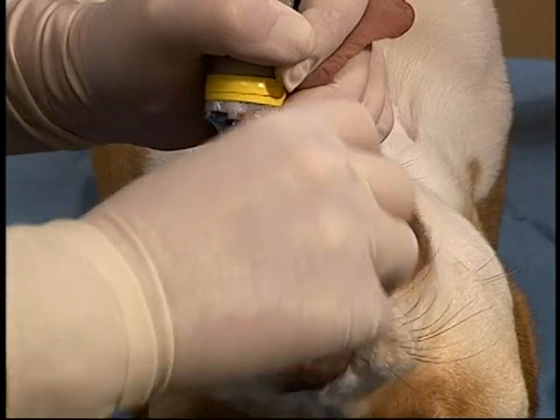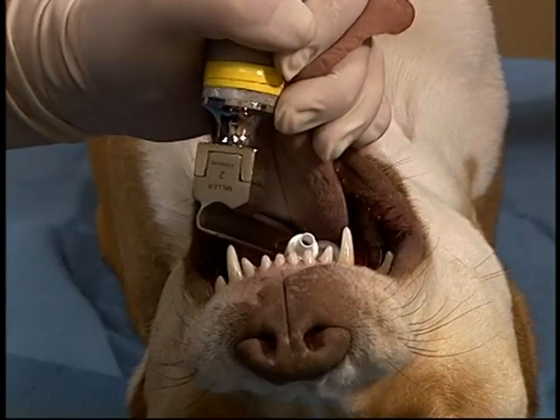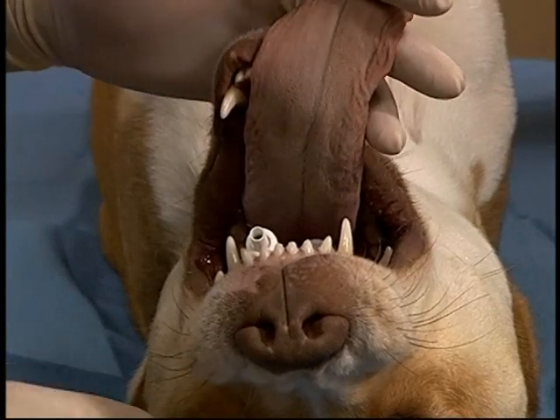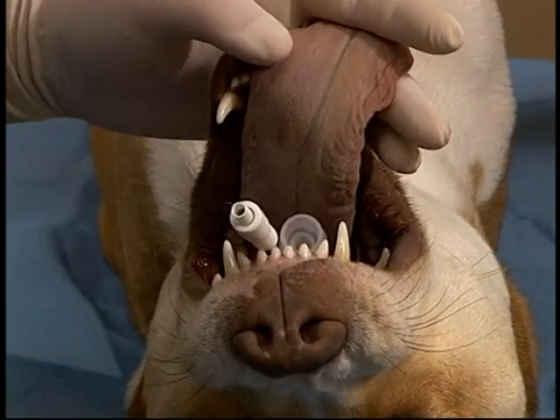The arytenoids are visualized and the tube is inserted. A tube typically one size larger can be inserted using this technique than would be used if the patient was intubated in sternal recumbency.